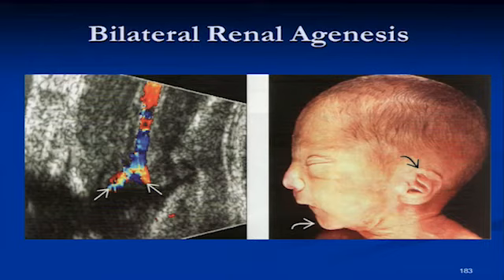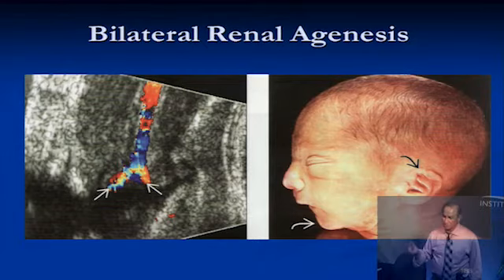So I'm on call and I got a phone call from my OB doctor on call. It's like, I need you to come and just help me scanning this baby here. So we transferred the patient at 33, 34 weeks from another hospital because of variable decelerations, okay? Fetal heart deceleration and no amniotic fluid. So quote unquote, rule out ruptured membrane.